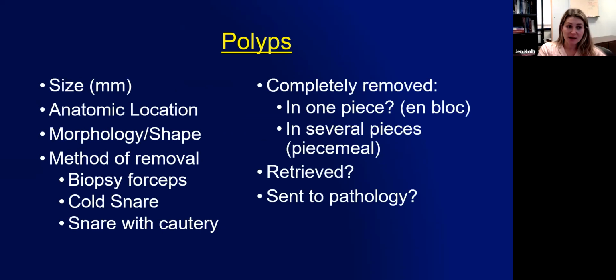So now I'm going to move into talking about polyps for the end of this and for the remainder of our time, because this is, again, I think, a huge area of confusion, but also there's always room for us, as a team, to do better in terms of how we report it and how we understand the findings.